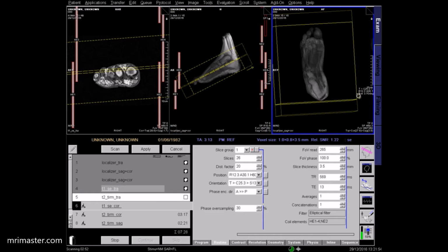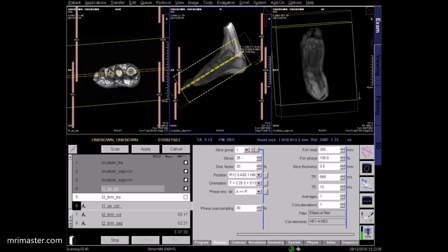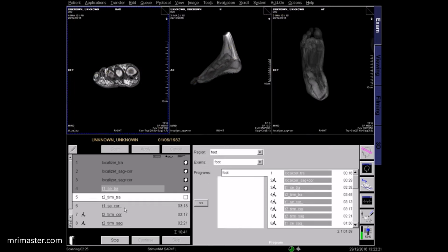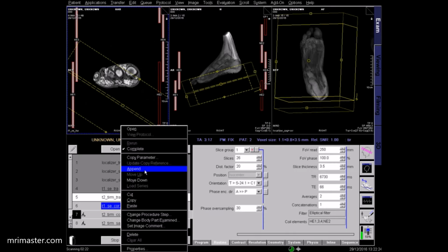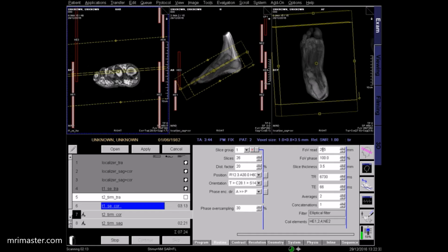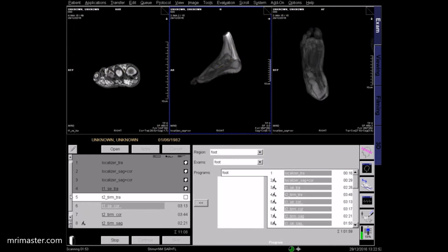Straighten and center the foot in the coronal field of view. Adjust your planning to ensure full coverage of the foot in all planes. Make sure the coils are turned on, and apply. For the STIR coronal sequence, copy the planning of the previous T1 coronal. Again, check the planning in all three planes, turn on the coils, and apply. You should review your images as the scan proceeds.